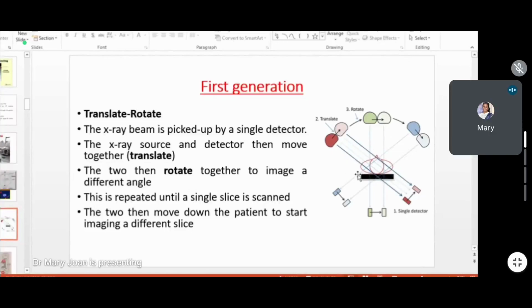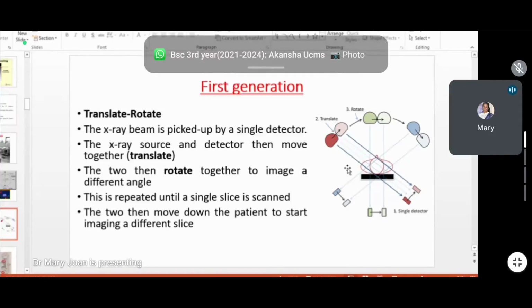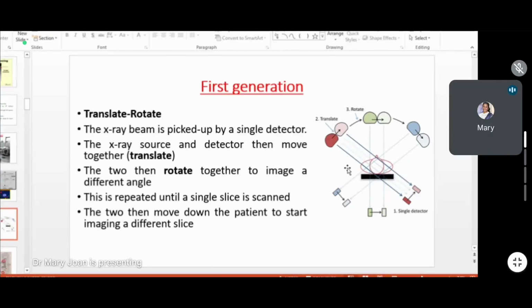And in order to get the three-dimensional information, while the data acquisition is done, X-rays are produced and passed through the patient body and detected. So the angles at which this is being done will be increased. The more angles at which we acquire images, the more information we will have about the inside in the three-dimensional space.